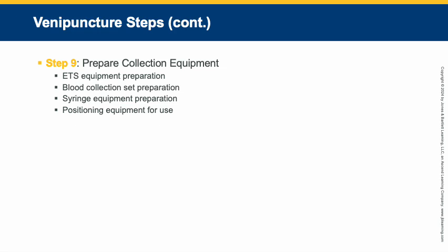Select the appropriate ETS tubes. Check the expiration date on each one to make certain it has not expired. Discard any tube that is expired.